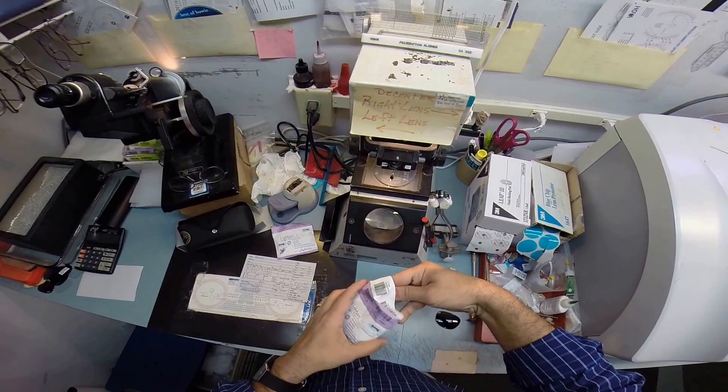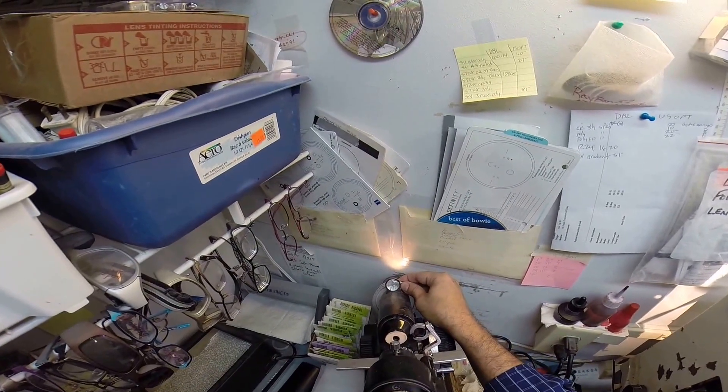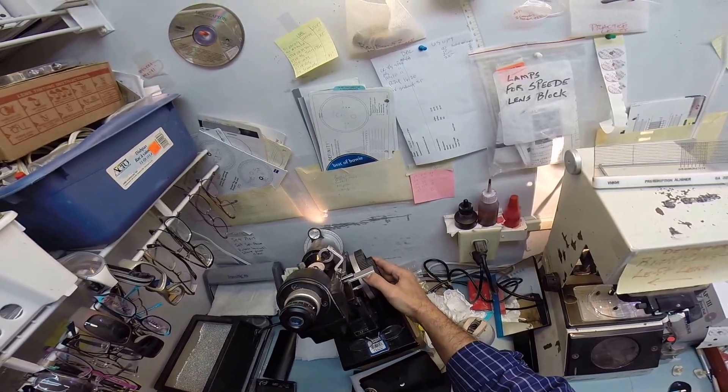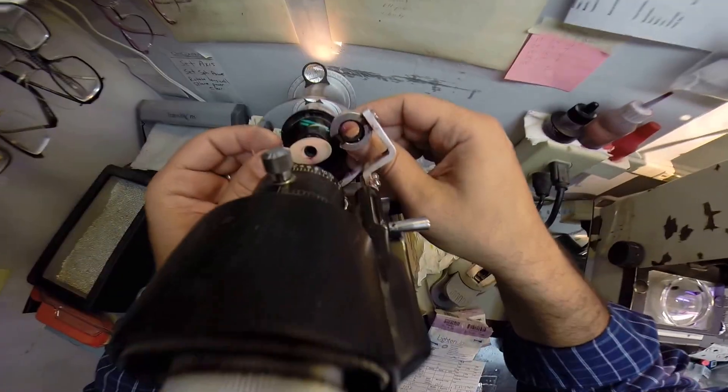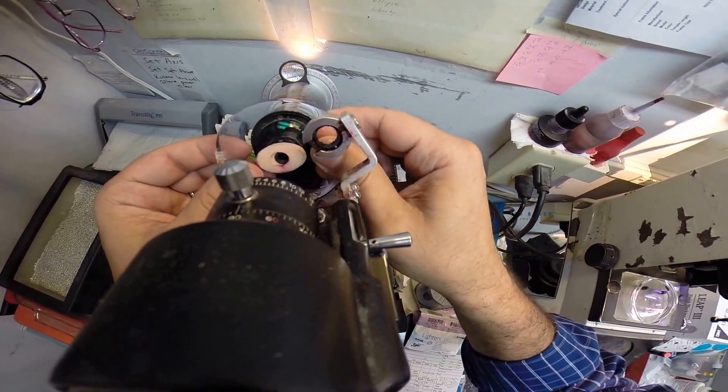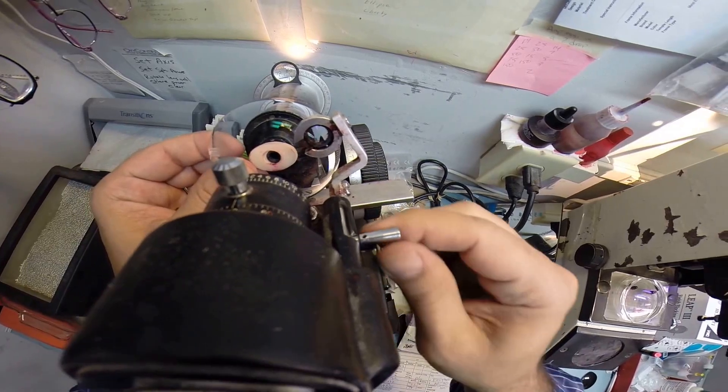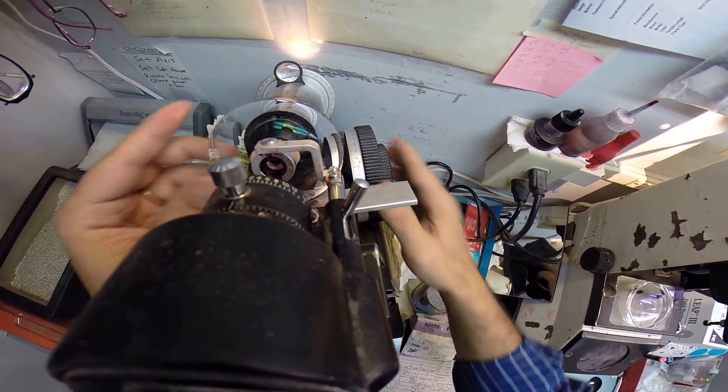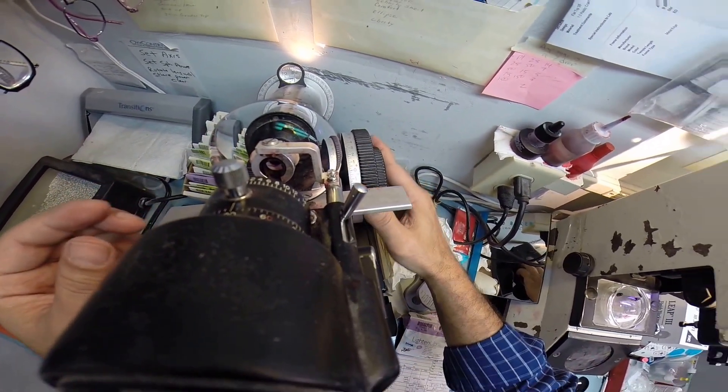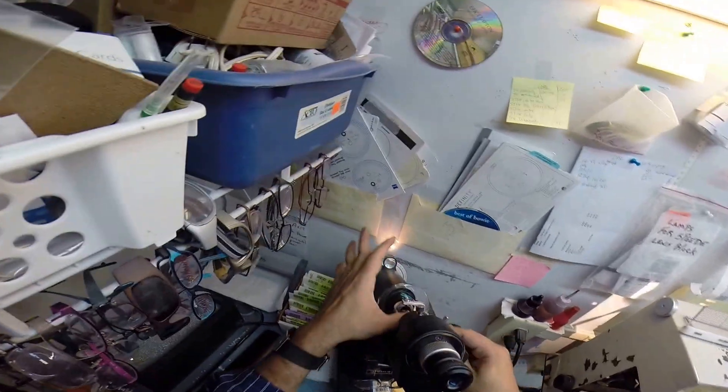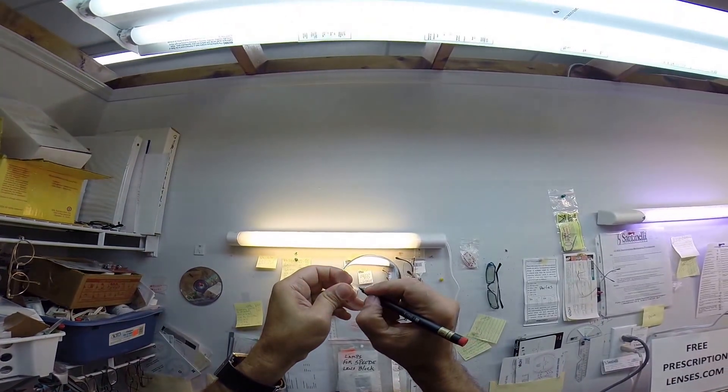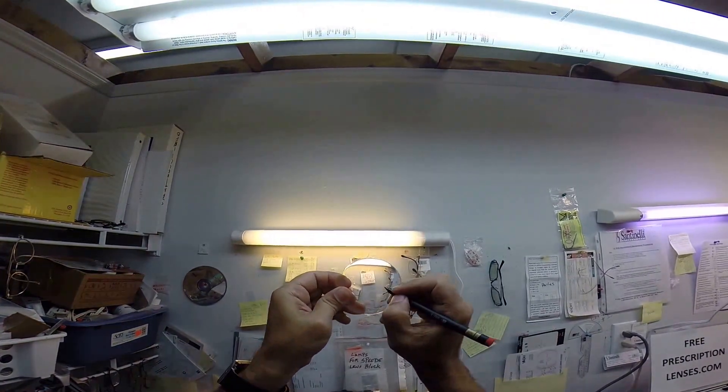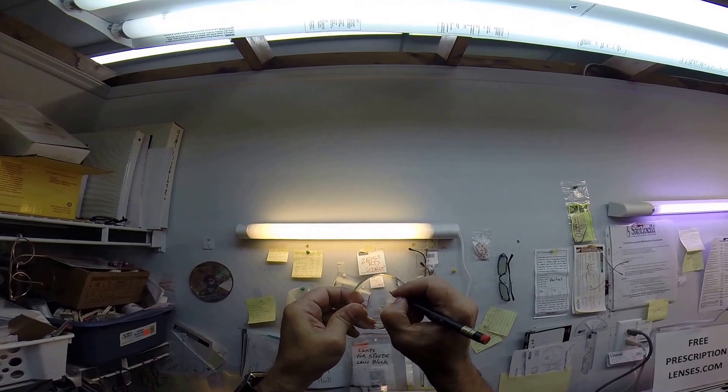Let's do the same thing for your left lens. Minus 4 and a quarter, minus 1 at 80. I'm going to spin the axis wheel to 80, put the power drum on 4 and a quarter. Put your lens in, rotate your lens so I find the sphere power clearly and the optical center. Let's put some new dots on your lenses. That is one, two, and three. And that is the left.